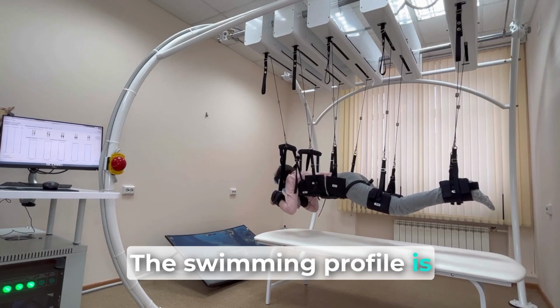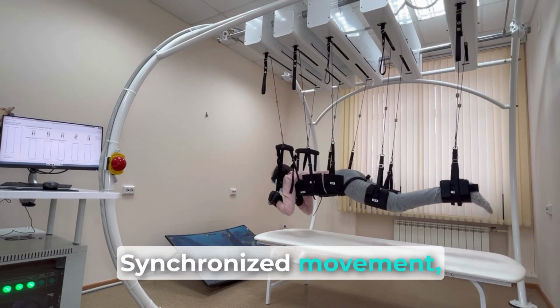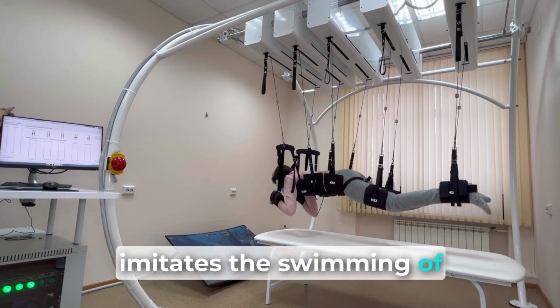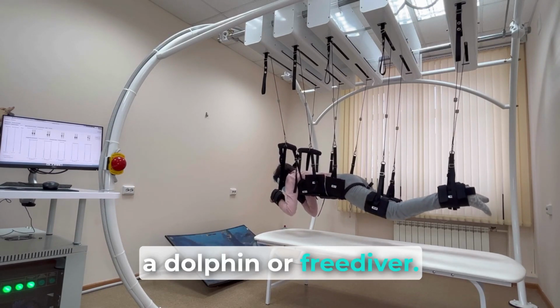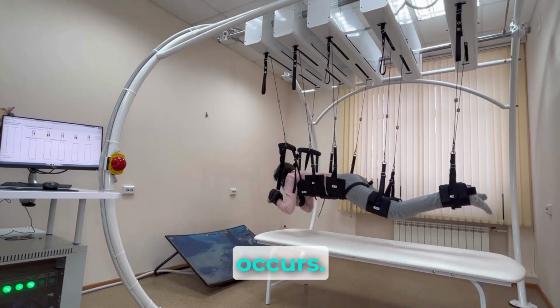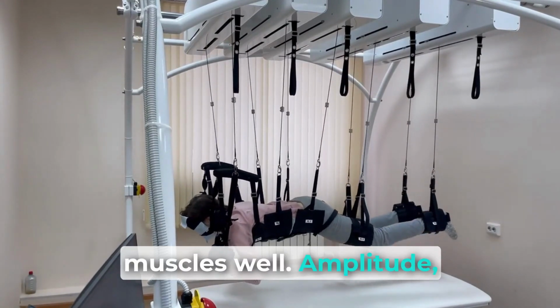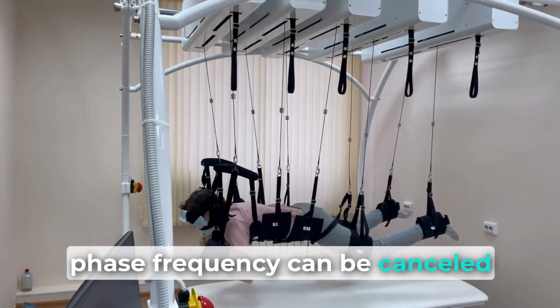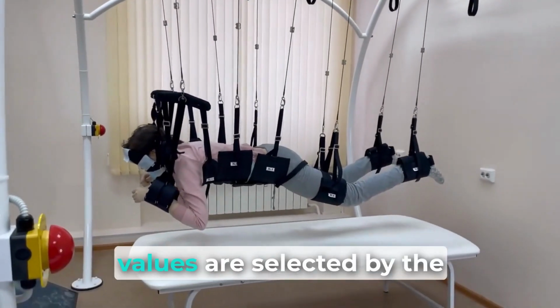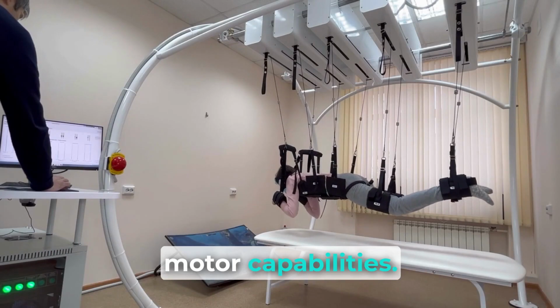The swimming profile is locomotion of medium complexity. Synchronized movement, where the left and right halves of the body move together, imitates the swimming of a dolphin or free diver. We start swimming lessons, especially when spasticity occurs. This locomotion relaxes the muscles well. Amplitude and frequency can be changed during movement. The amplitude and frequency values are selected by the operators of the complex depending on the patient's motor capabilities.